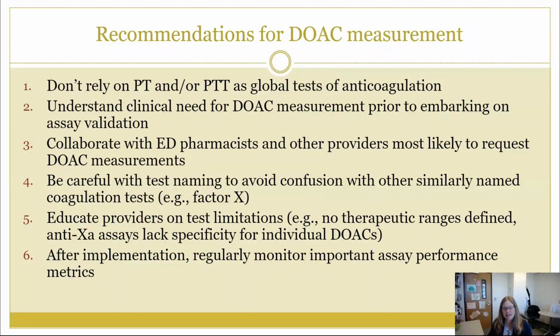If you have been asked to develop or provide or have assays available for DOAC measurement, I encourage you to really make sure you understand the clinical need for this prior to embarking on assay validation, because most of the time this is going to be a laboratory developed test, which is really resource intensive for the laboratory. Understanding exactly how the providers plan to use the results and how quickly they need the results will help you gauge what is feasible and fits what the providers need. For us, that was really a good collaboration with our emergency department pharmacists, because they were the ones most likely to be requesting these measurements and knowing how to use them.